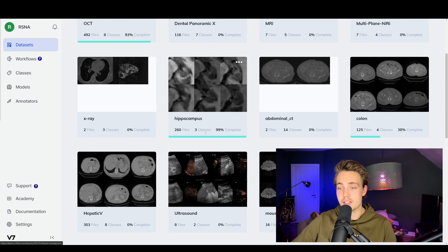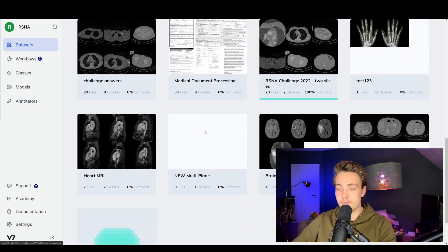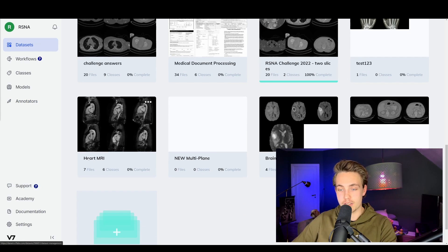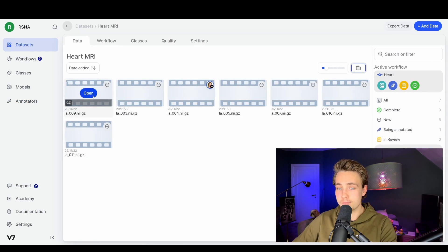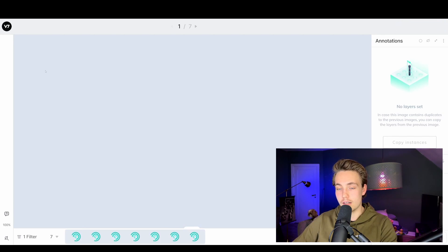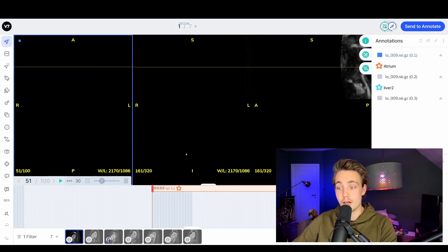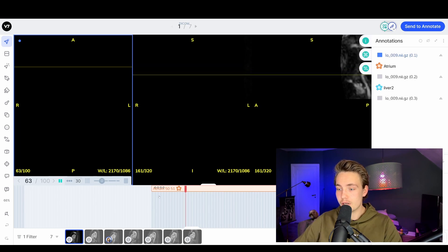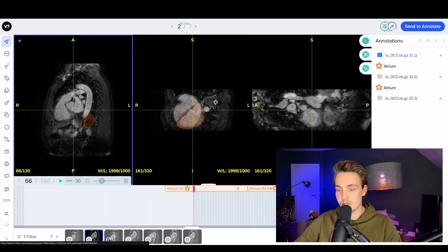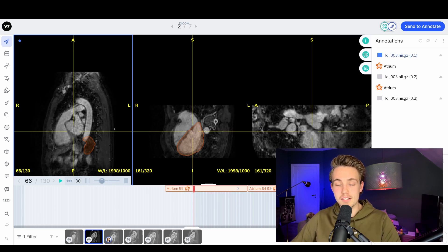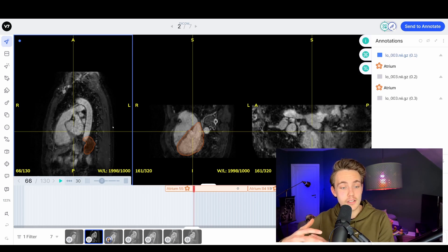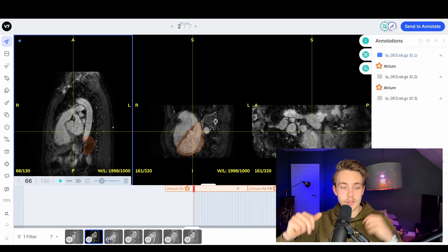First of all, we have these different datasets. I'll go down to the bottom and take an example - the heart MRI scan. We can just open up one of the files in the folder. We get these different views, and when we go to one of them we can see three different views. So we have this DICOM viewer experience.